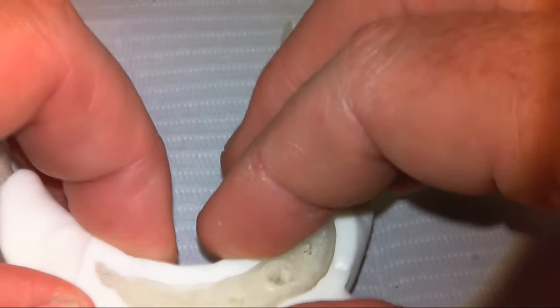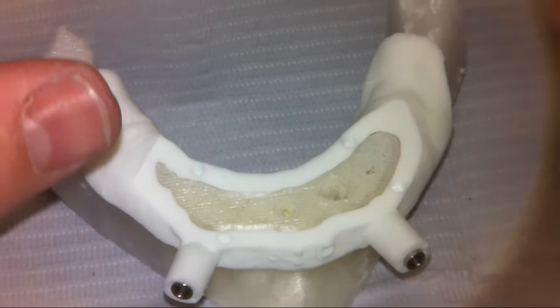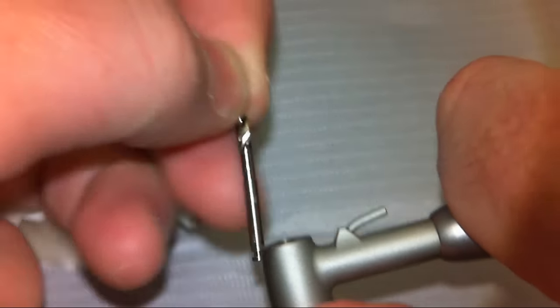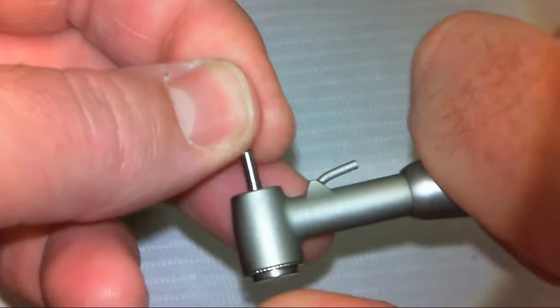For demonstration purposes, in this case we'll be doing a full arch type case, where bone reduction has already been done. The way you can work this — when I made this in the Blue Sky software, everything gets pre-programmed for you as far as where the drill sleeves need to be.